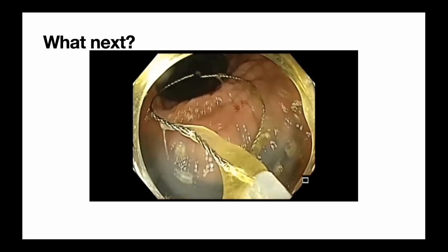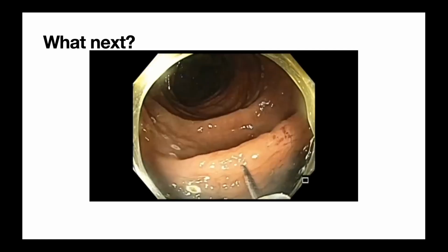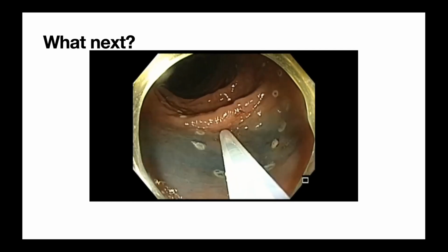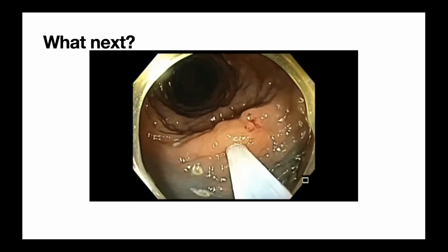All right. We'll look at an SSA with dysplasia, you mean, Roy? SSA. No, I don't see the TSA that they're talking about. It can't be a TSA, but I think that's... Can we look at the images again?